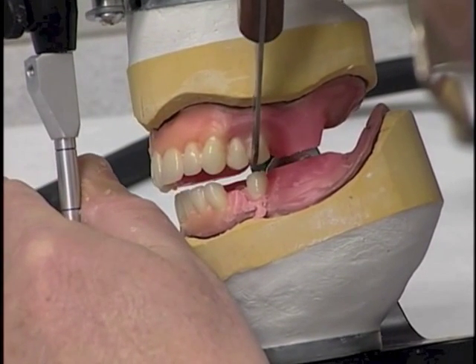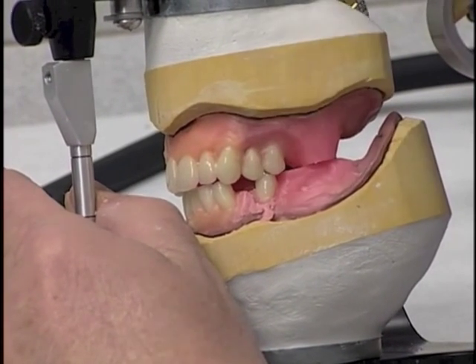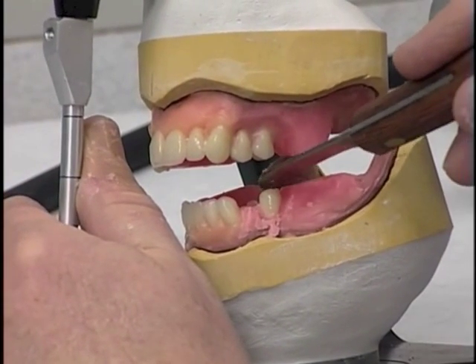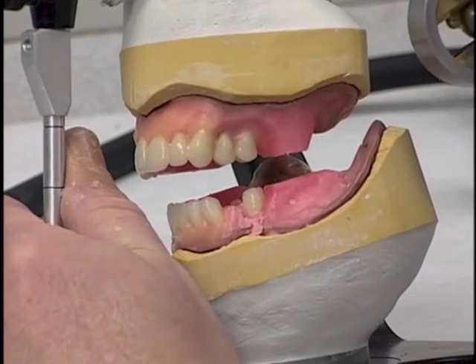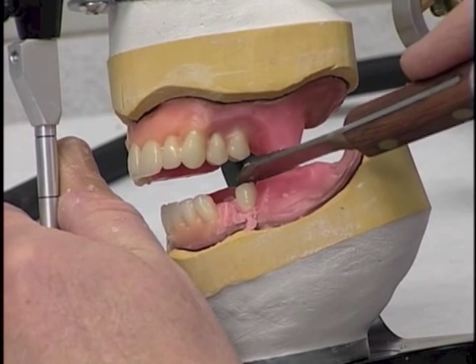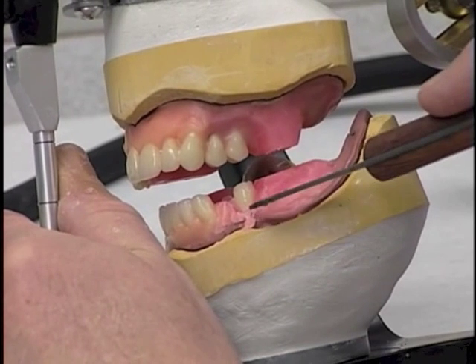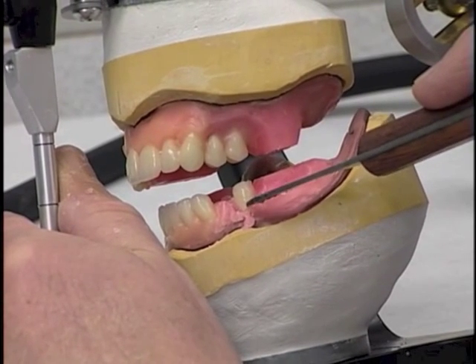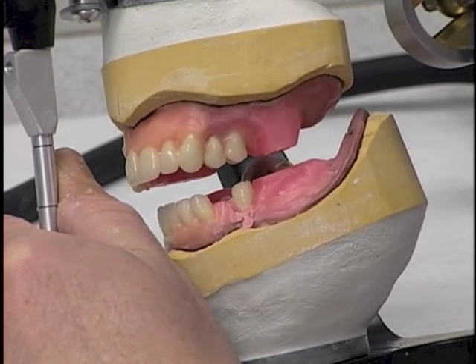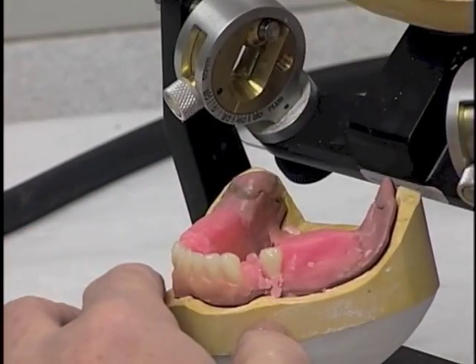The cusp tip of the mandibular is fitting right in the embrasure formed by the maxillary first and second premolars. Now the only problem that we have with this now is that the lingual cusp of that mandibular second premolar is sitting much too low. So we have to rotate that tooth enough now to raise the lingual cusp up to approximately the same plane as the buccal cusp. In order to do that, we're going to have to put the gingival part of this mandibular second premolar farther lingual, and that will rotate the tooth to get the lingual cusp up into its proper occlusion.